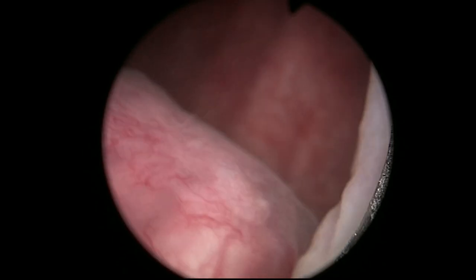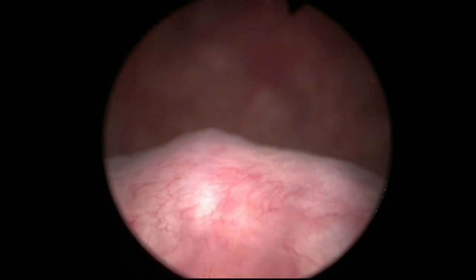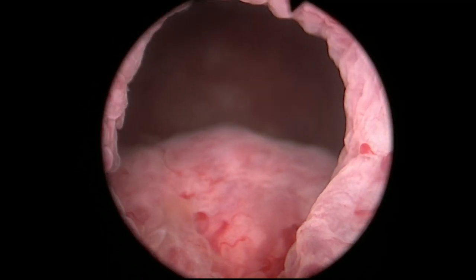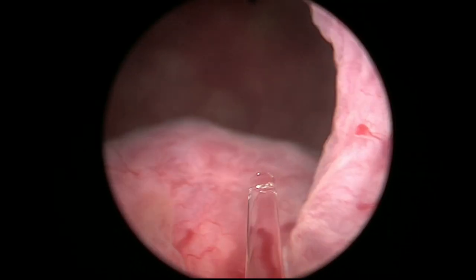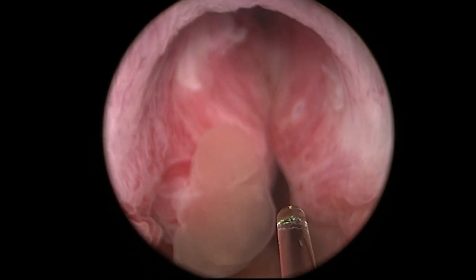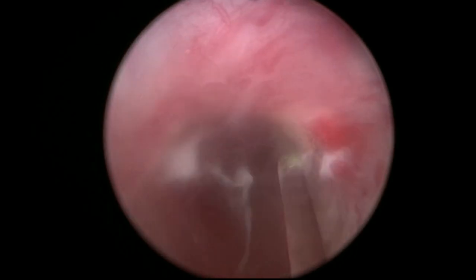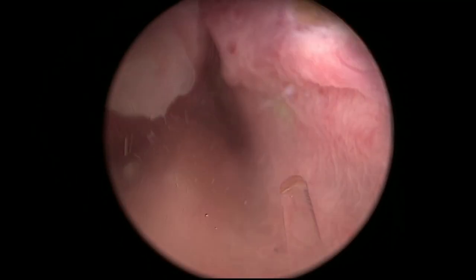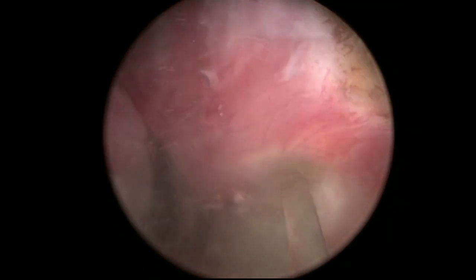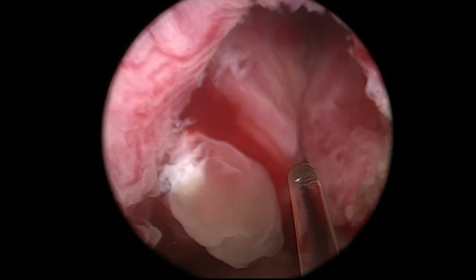You can see a very inflamed bladder mucosa in this patient. His urine culture was sterile, but probably that urine never emptied properly for a long time, so that's why there is some stuff in the bladder. I like to empty the bladder, and if the urine smells bad, I would stop the procedure immediately, because that might signal an infection and risk of sepsis. But in this case, there was no bad odor, so I started localizing the sphincter edge and marking the white line at the apex.